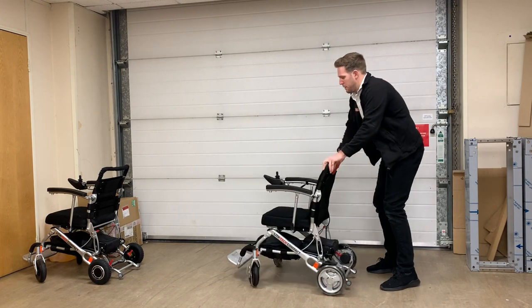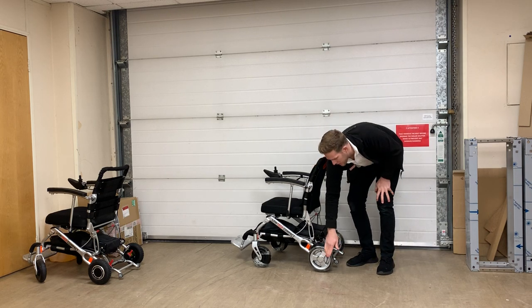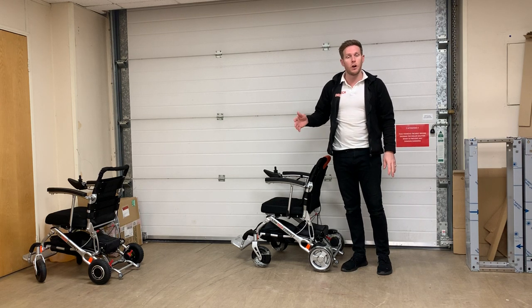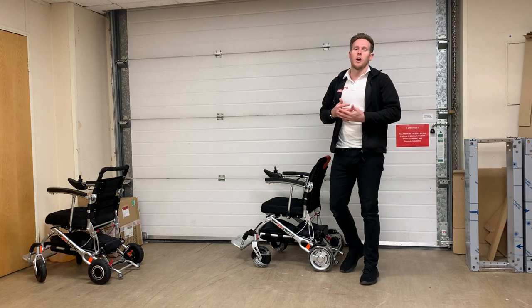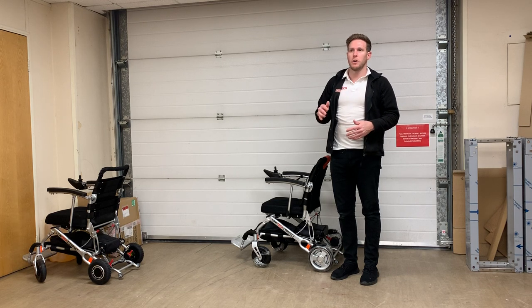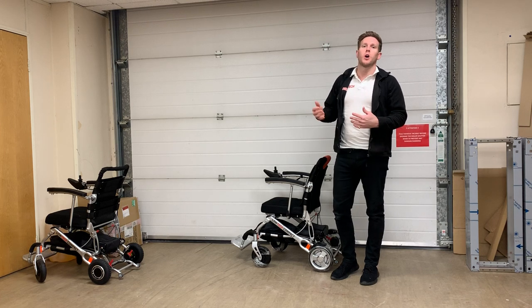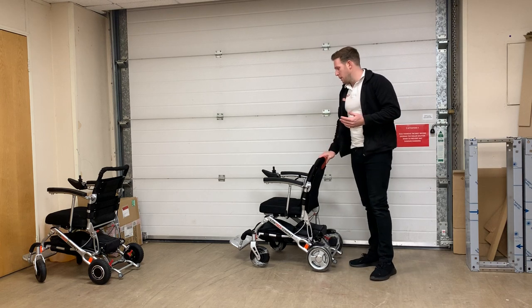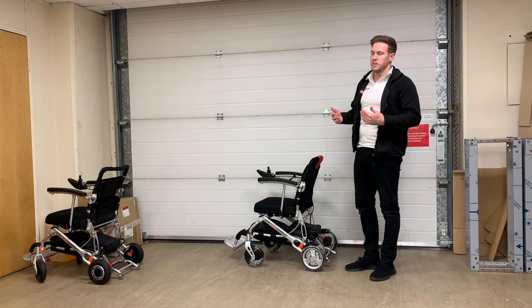These are the new upgraded wheels and motors for 2020: eight-inch solid puncture-proof tires on the rear and seven-inch solid puncture-proof tires on the front. The front ones especially are very squidgy, which helps over rougher terrain like cobbles. The chair can still do cobbles, potholes, and uneven terrain, and can handle drop kerbs — but you won't be able to do full kerbs like you can with chairs with the bigger 12.5-inch wheels. That's just the compromise you get for having such a lightweight folding wheelchair.